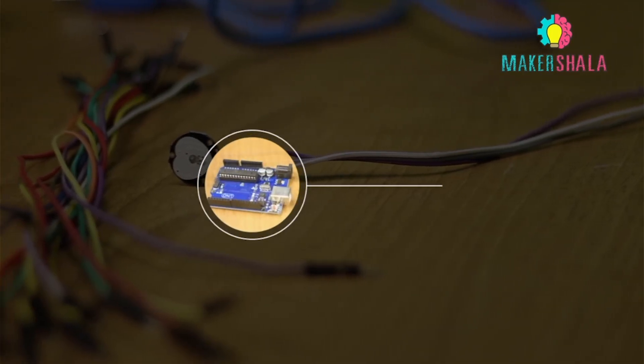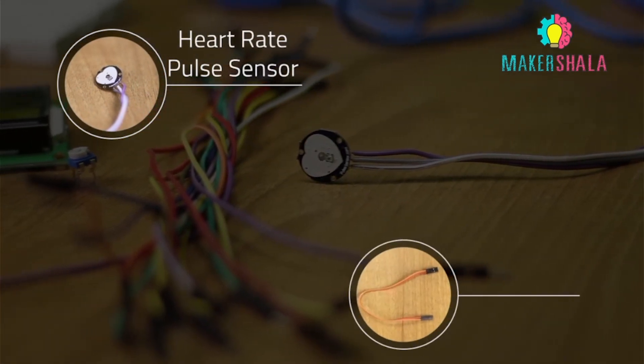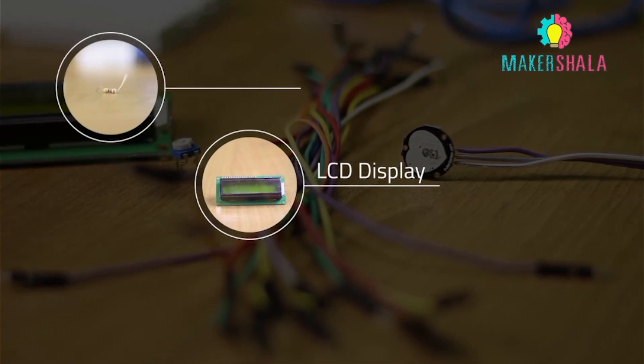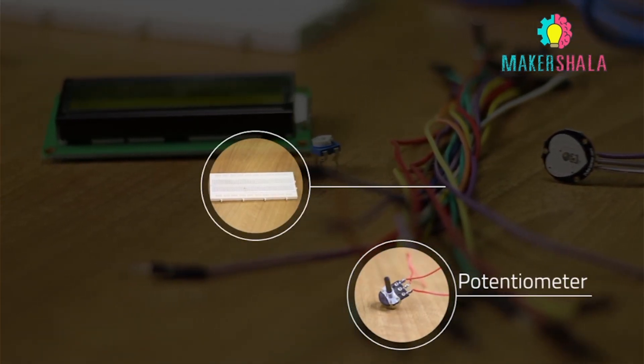To build the circuit we will require: an Arduino, a heart rate pulse sensor, some jumper cables, an LCD display, a 1k ohm resistor, a potentiometer, and a breadboard.